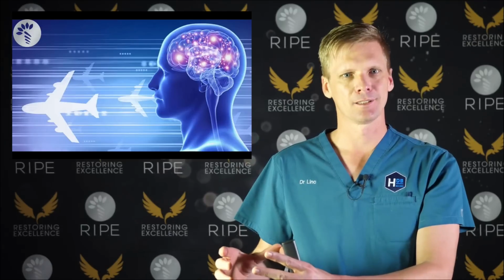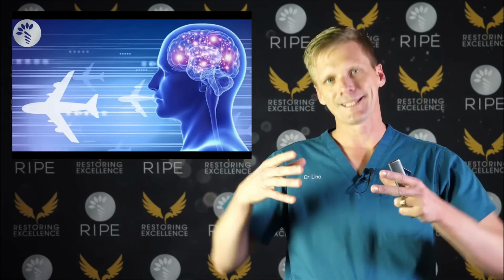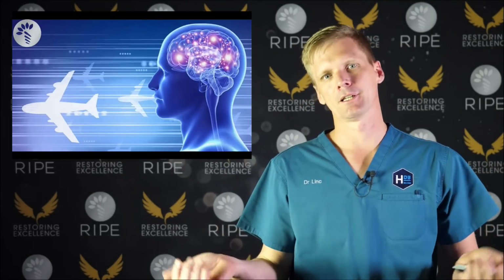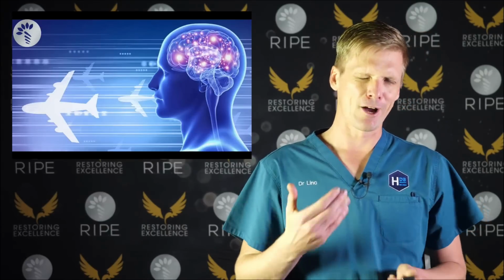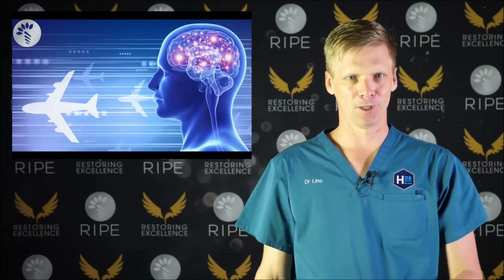That's the data that gets recorded. It doesn't matter whether you take it with silicone or with a scanner. That is the data that you're going to send off. That's what everything is going to get built on. So it's the most important thing, but we do it at the end when we're tired. And so today, I thought maybe I can get away with no retraction cord, not doing all the usual 30-40 minutes of putting cord in, and I took the first impression and it was terrible. I did a second impression. So today I was just reminding myself why you have to do it the way I teach, or something similar to this, to get perfect impressions first time.